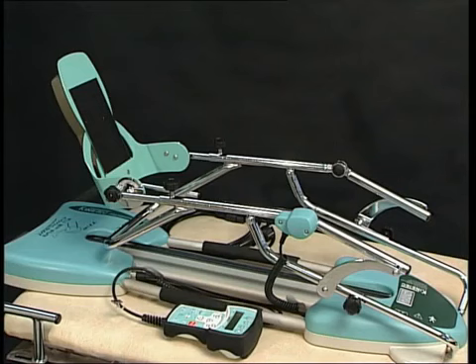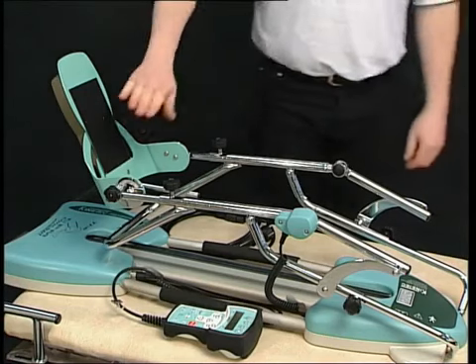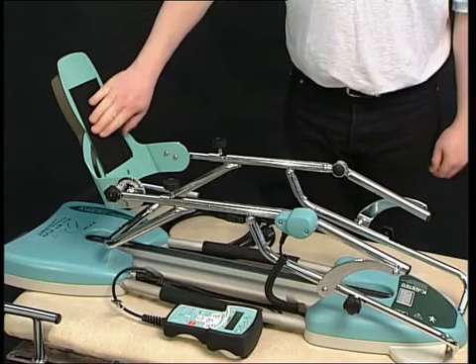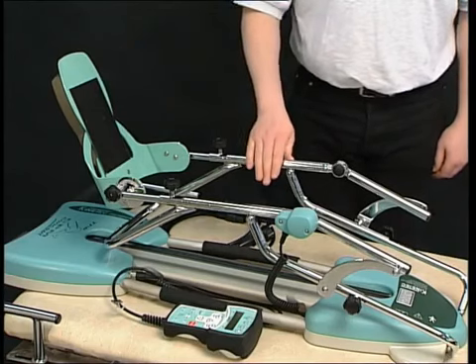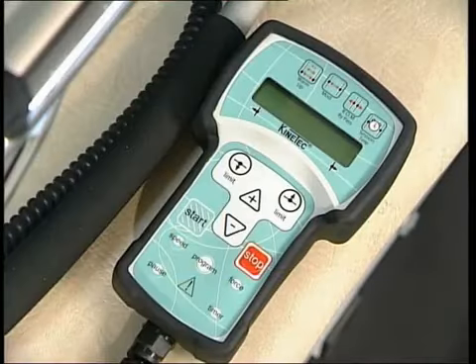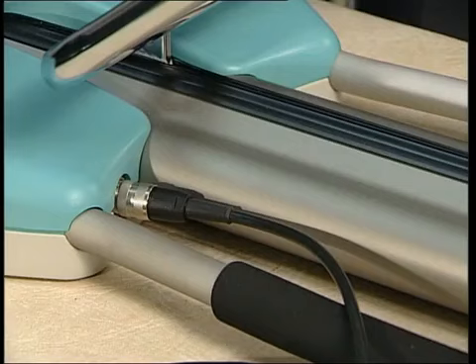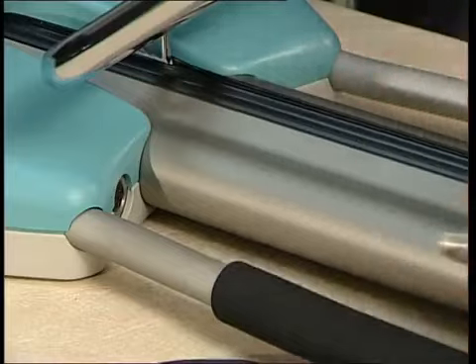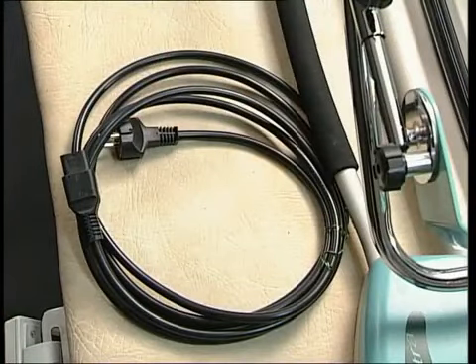The Kinetec Spectra machine comprises an articulated foot plate, which can also be used to hold the remote control, a leg support, a thigh support, a leg support here made of molded plastic, a remote control device for setting the various movements, which can be disconnected for maintenance purposes, and a mains cable.